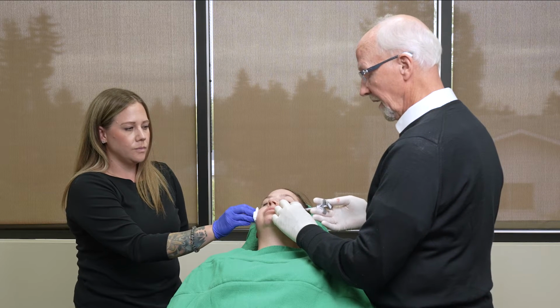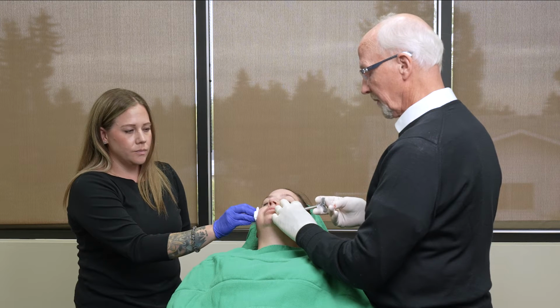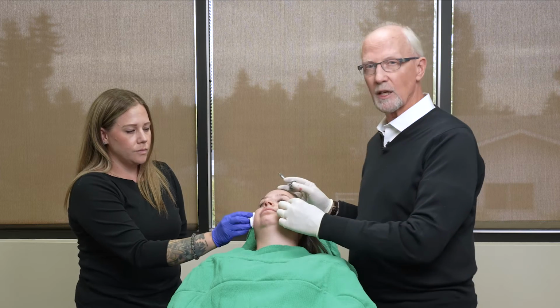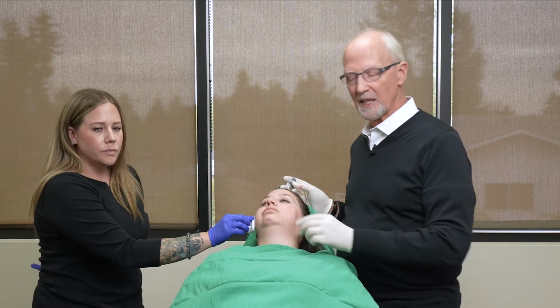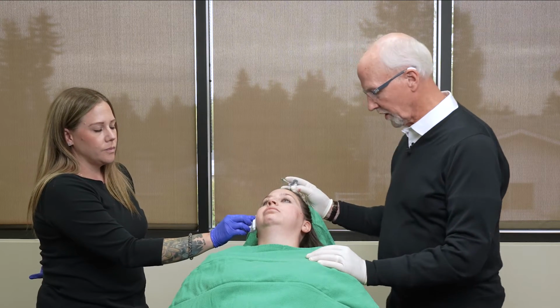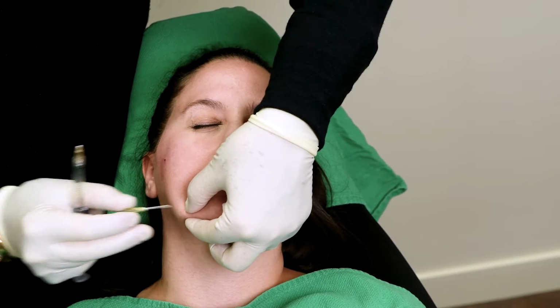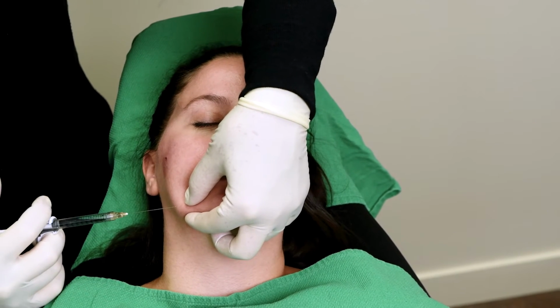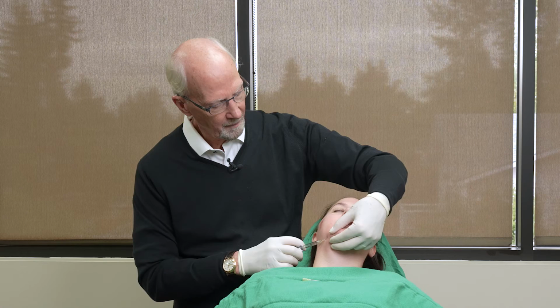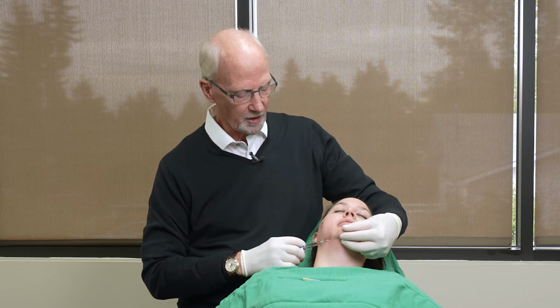And then we'll look at these areas afterwards to identify the placement of our product so that we'll see is it where we expected it to be? Is the amount that we anticipated to be in the area to give the correction that we're looking for? So we're just going to inject here along the mandible. So we've just gone in through the surface of the skin. We'll run this up to the tip of the chin, and then we'll slowly inject along here.